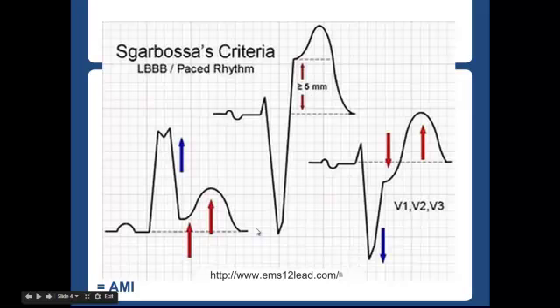The second criterion applies in V1, V2, or V3. You'll generally have discordant waves — a negative QRS and a positive T wave. However, here you have a depression that is concordant with the QRS, meaning it's in the same direction. So you have an ST or J point depression greater than one millimeter. That's your second criterion.